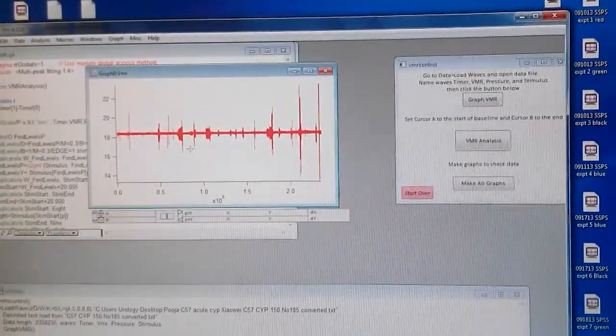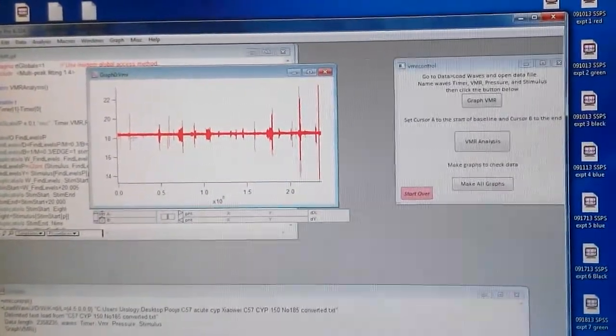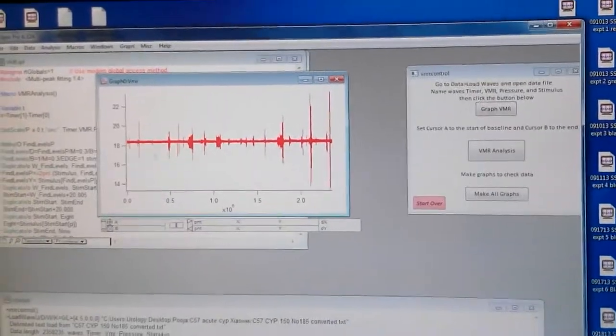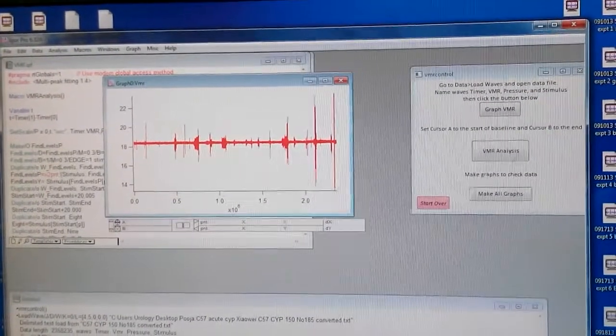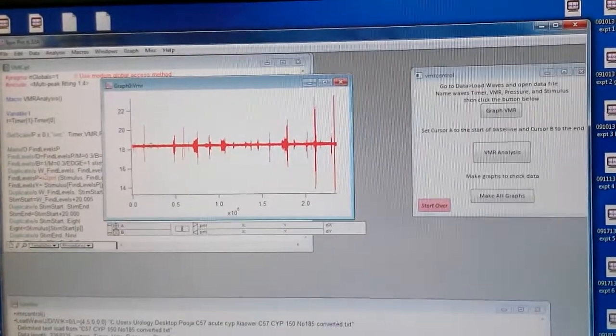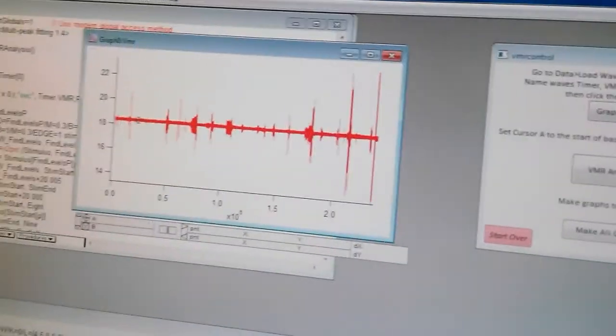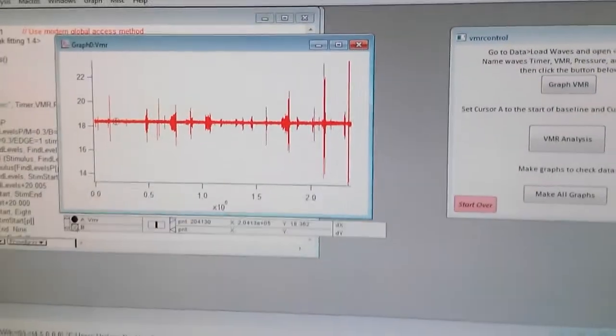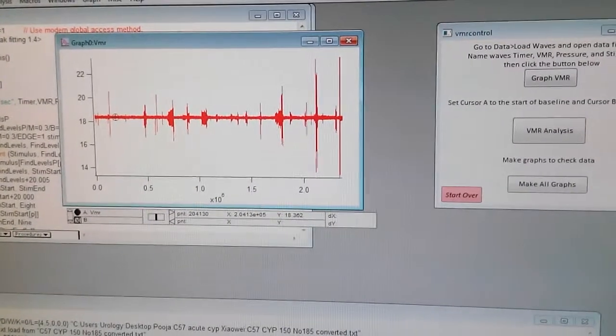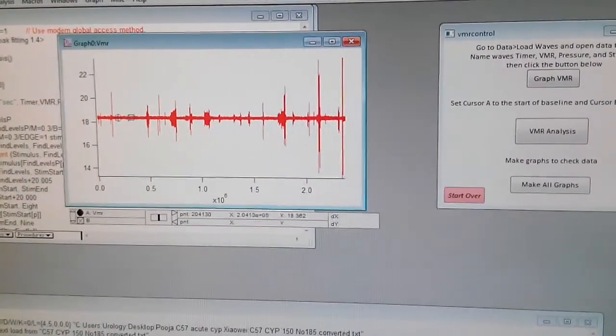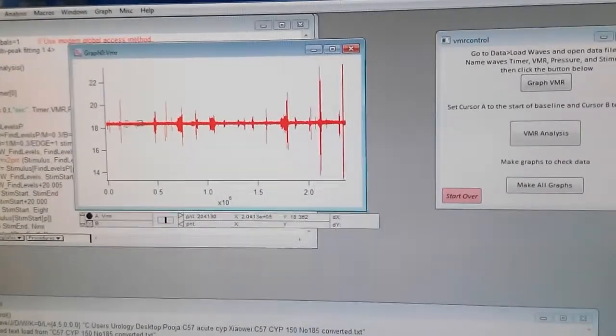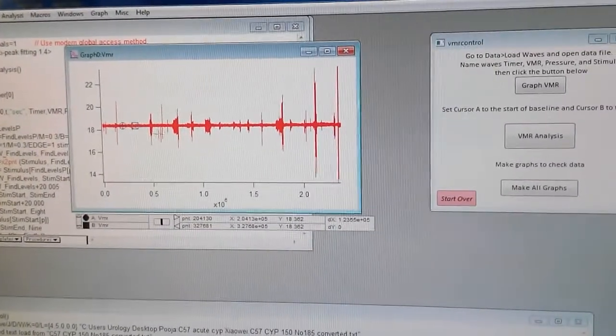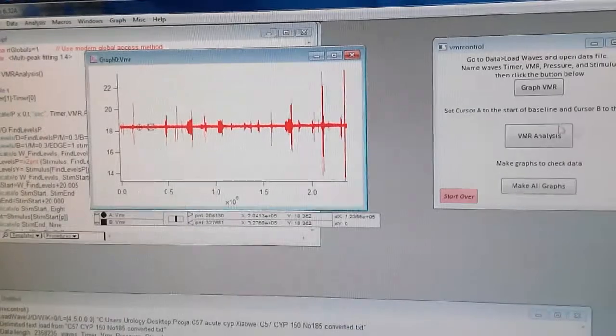Now you have to click the background. So we have to, so that way it can control, it can take the control or the line or what they say. You try to align these boxes. Once you are done with this, you click on VMR analysis.